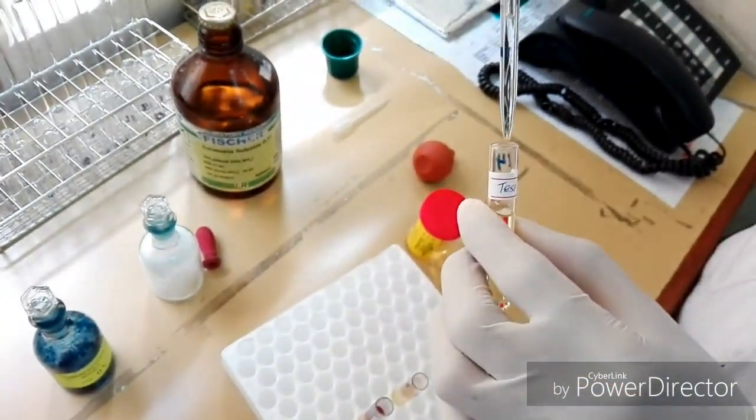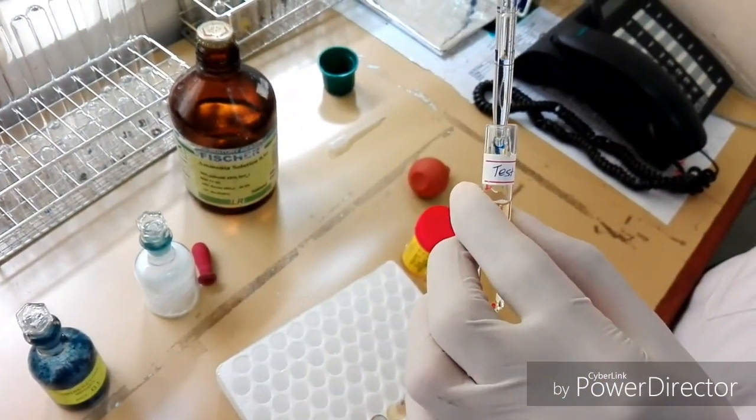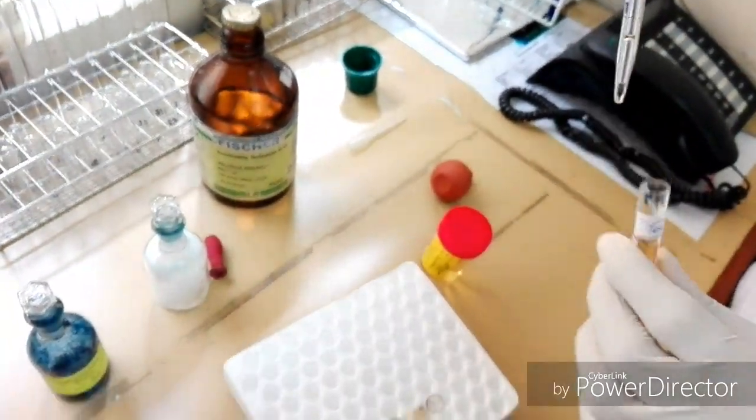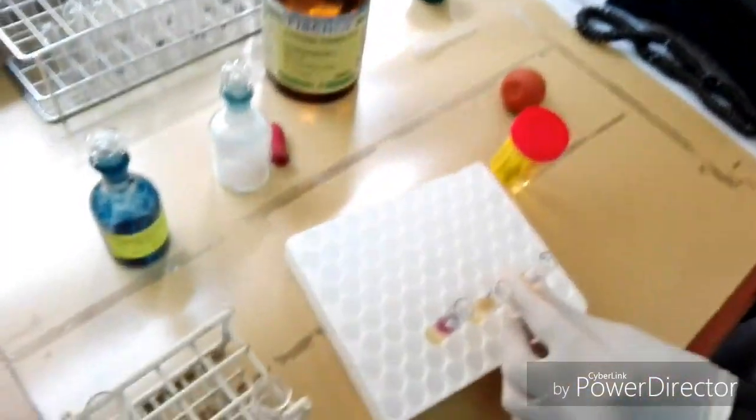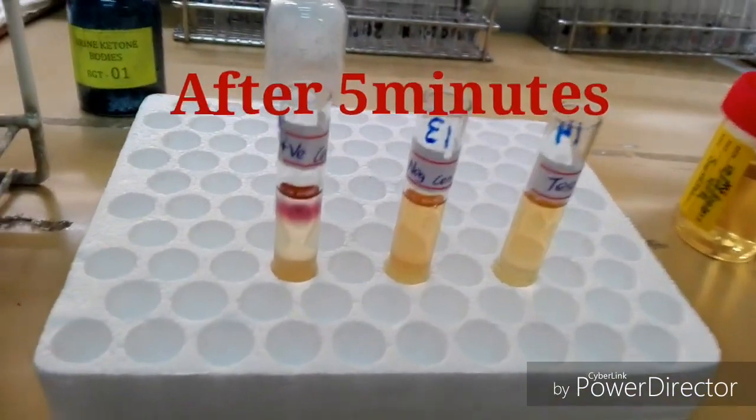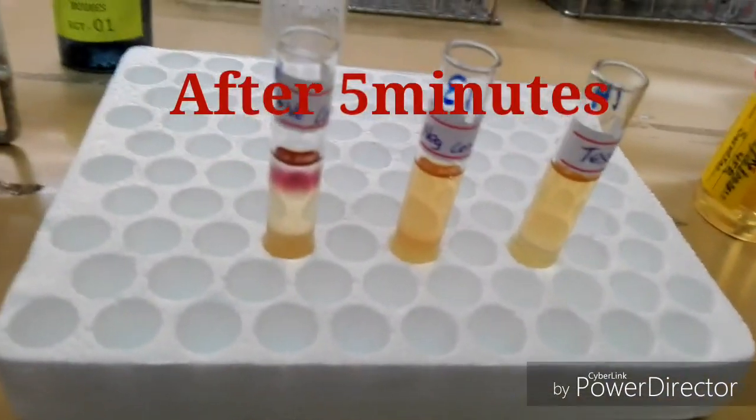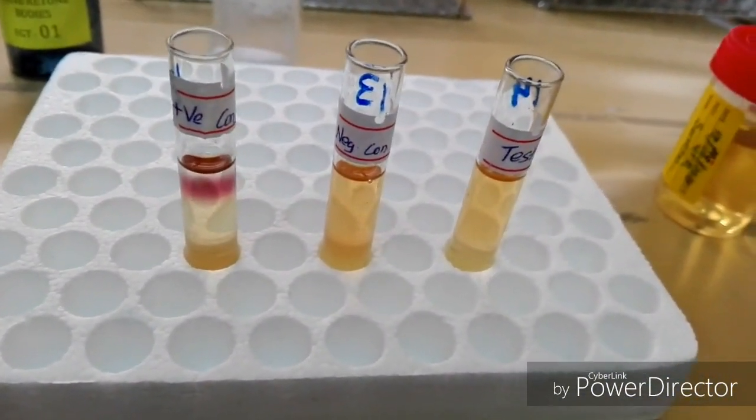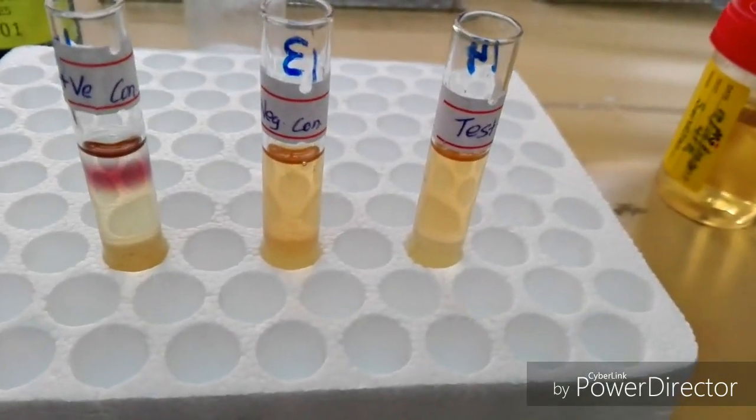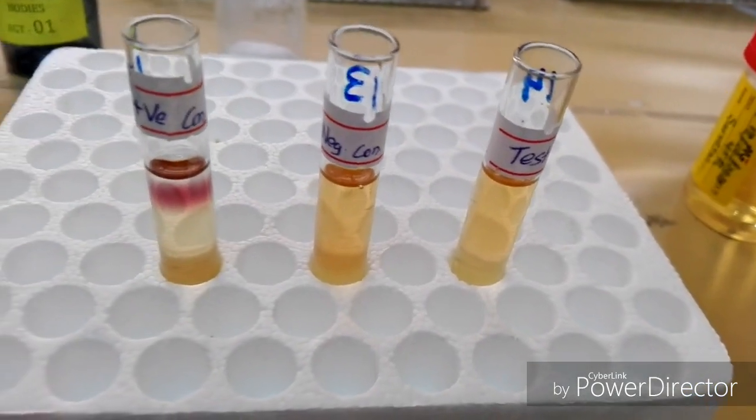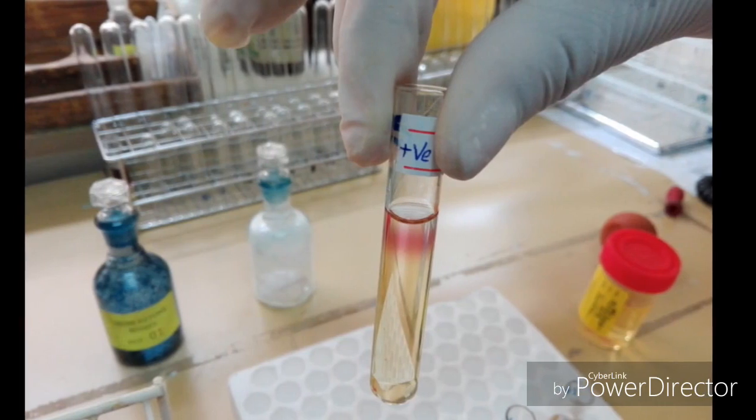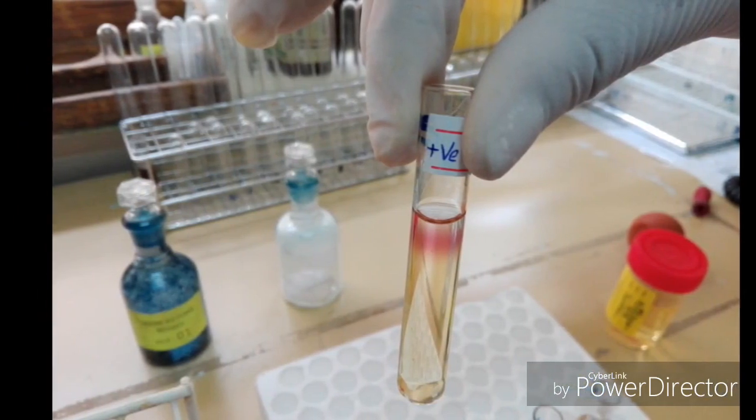As a result, we can observe a permanganate purple color ring just below the ammonia layer. Here, the positive and negative controls are okay. The positive control shows a permanganate purple color ring, and the negative control shows no ring. The test also shows no permanganate purple color ring, so therefore there are no ketone bodies present in the test sample.